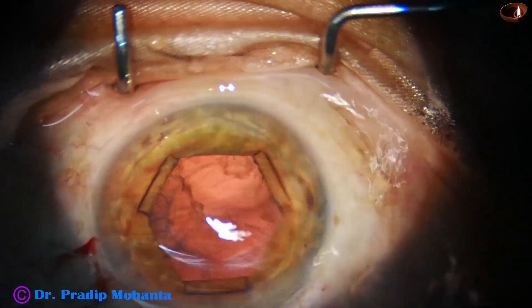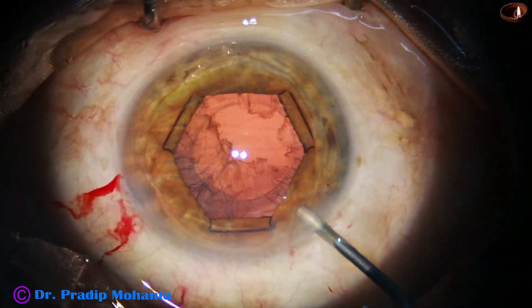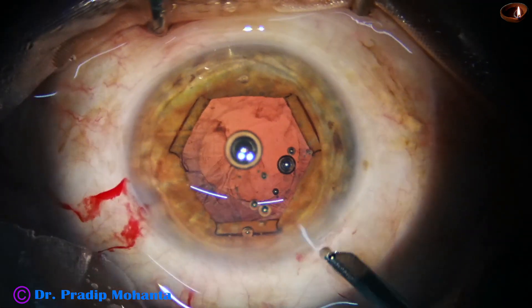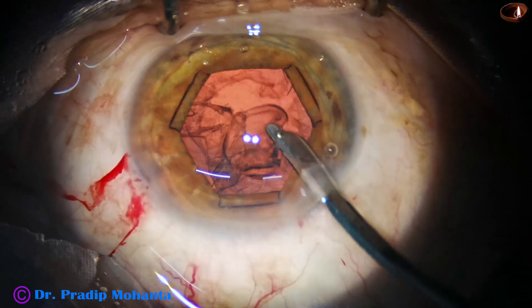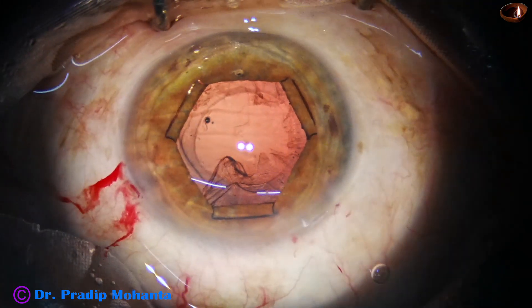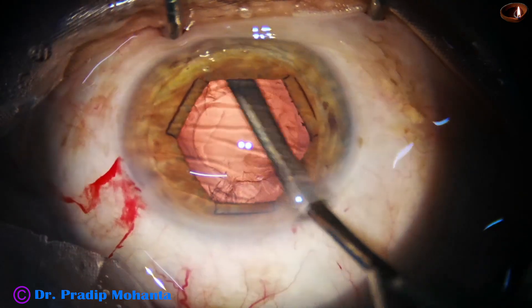The nucleus is managed and the epinucleus is also managed. Now I inject VISCO and go and remove the cortex.